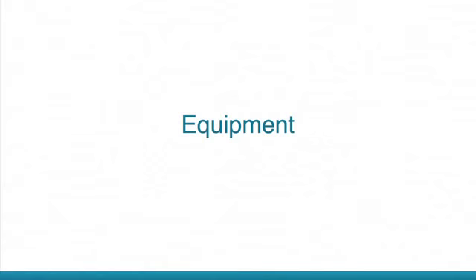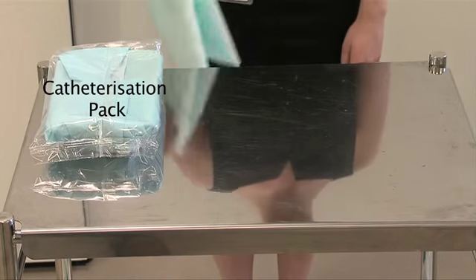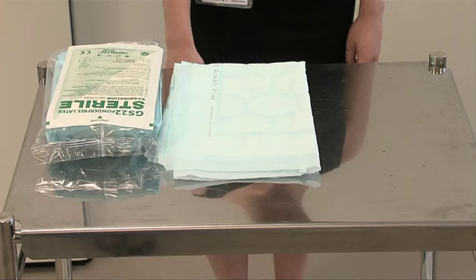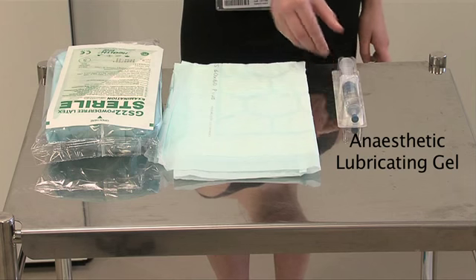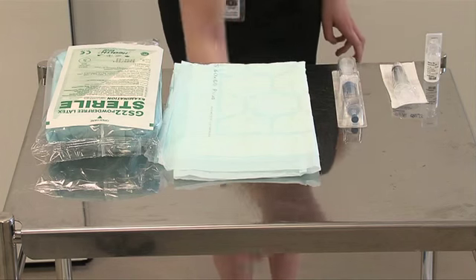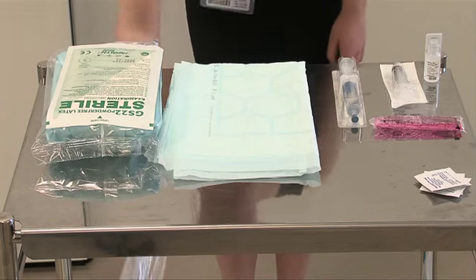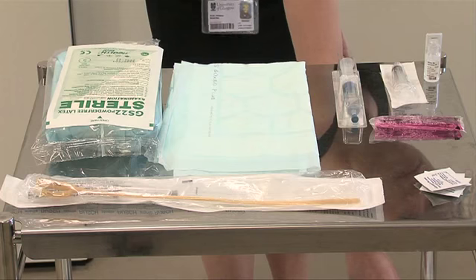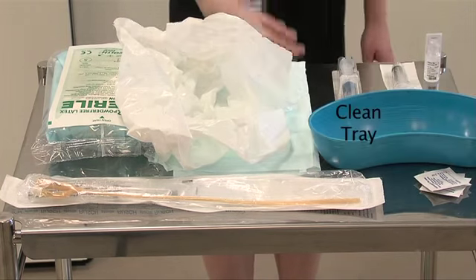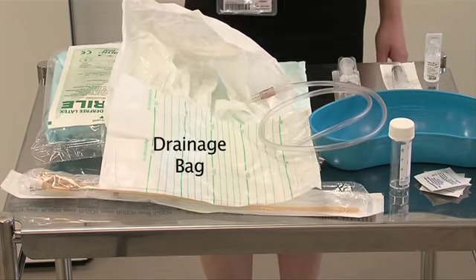Thank you. The following equipment is required for urinary catheterization: a sterile catheterization pack, a disposable pad, sterile gloves, anaesthetic lubricating gel, syringe, sterile water, antiseptic solution, alcohol wipes, an appropriate catheter, a disposable plastic apron, a clean tray, a universal specimen container, and a drainage bag.